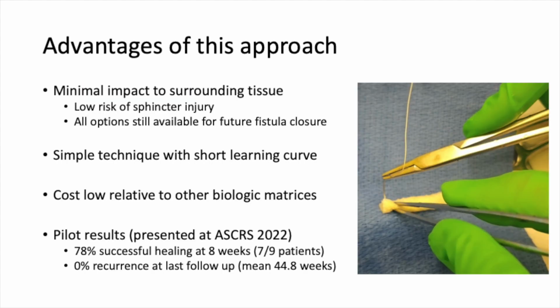First, it has minimal impact to surrounding tissue and therefore low risk of sphincter injury, and all options remain available for future fistula closure in cases of failure. It is easy to learn and has a short learning curve, and has low cost relative to other biologic matrices. And in our pilot results presented at last year's ASCRS, we noted 78% successful healing at 8 weeks and 0% recurrence at last follow-up. This technique is the subject of ongoing investigation at our institution.